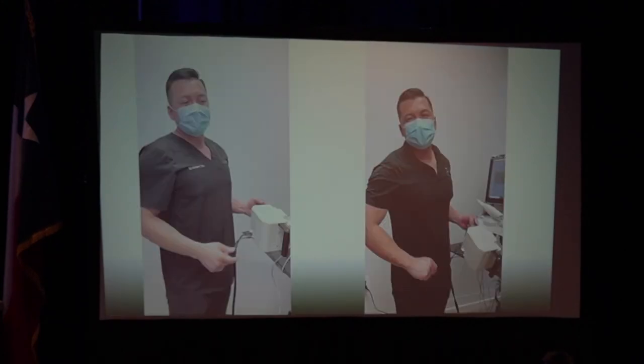Okay, somebody asked me at the last course. I don't think we have time to go through this, though. You want to go through this? Okay, so somebody asked me, what if you're opening the bite? Well, this is what you do. You either do a Lucia jig or a leaf gauge. This is why my course kind of gets confusing to some people. I'm sorry if it does, but I'm having to answer all these questions because people are like, how do you do this? So this is how you do it.